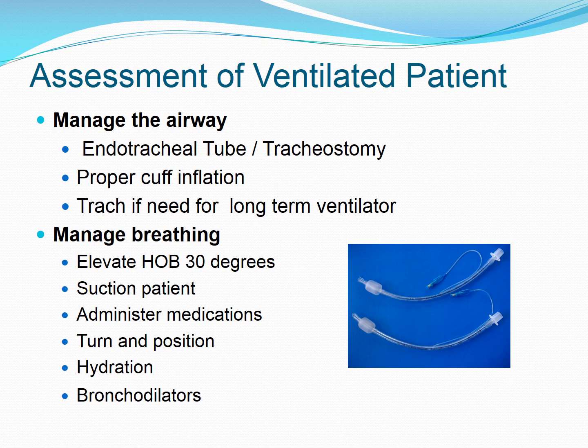I have just on this page a couple of pictures of an endotracheal tube. So you'll see where the balloon is blown up in that endotracheal tube. And as I said, we have to be concerned about tracheal necrosis and damage, which is why they can't leave these in more than a couple of weeks.